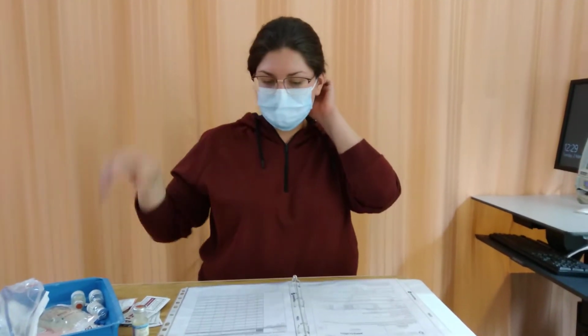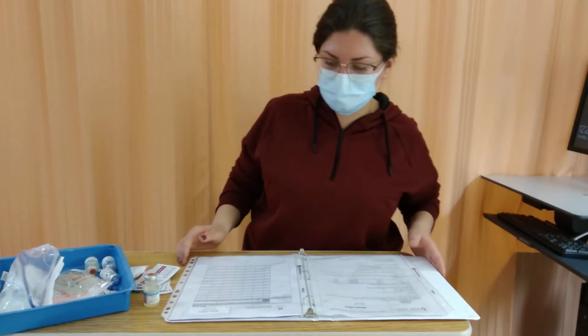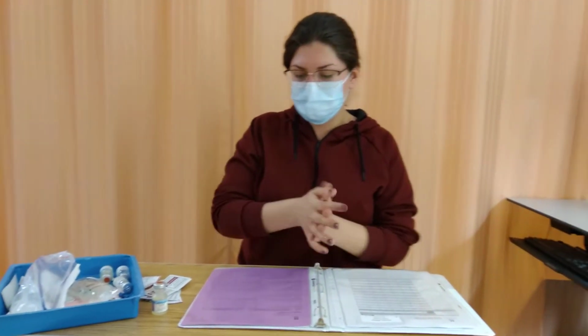To administer secondary IV medication through a secondary IV bag. Okay, so we've already compared our MAR with our physician's order and they match, so we're good to go. I'm just going to do hand hygiene really quickly.